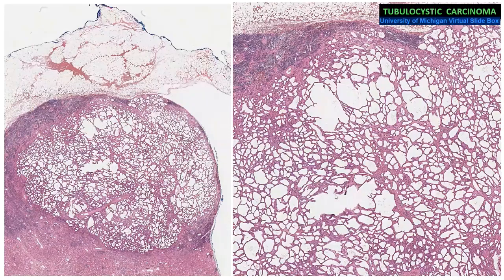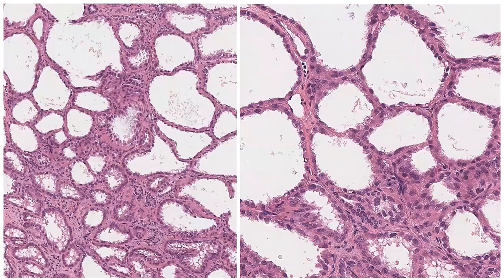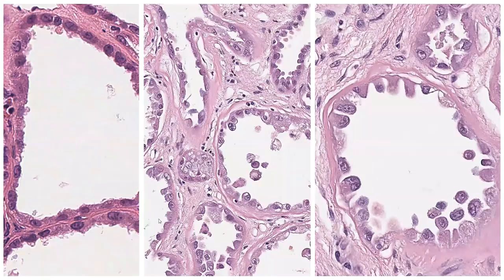So in this particular case, as you see, there's a very well circumscribed tumor, which is clearly delineated from the perinephric fat, and which on a higher power appears to have a mostly tubulocystic morphology. These tubules are of varying sizes and are lined by monolayered cuboidal cells. And these cuboidal cells have got prominent nucleoli. The cells are cuboidal to hobnailed, so you can appreciate the hobnailing of the cells towards the luminal aspect and appreciate the large size of the nucleolus as well.